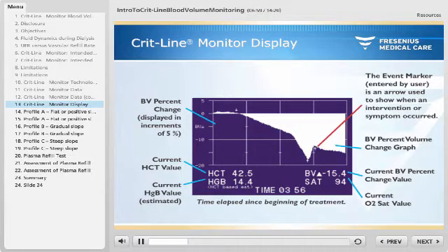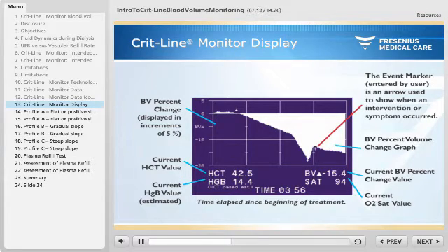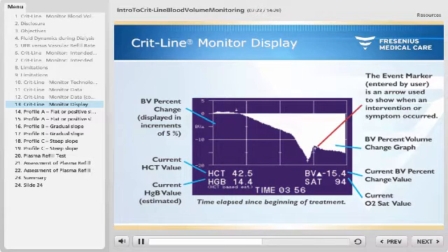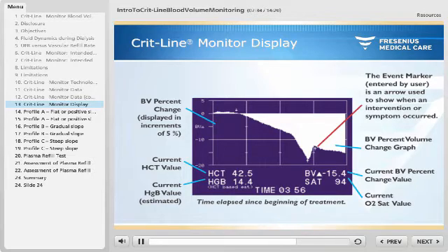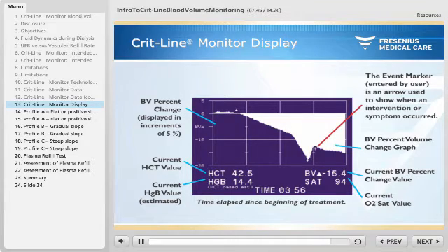Each vertical line of the display represents one hour of elapsed time since the start of dialysis. The screen initially shows four hours but will rescale if the treatment exceeds this time. The horizontal lines represent the percent change in blood volume relative to the start of dialysis; thus, the line always starts at zero. Positive values above the zero line signify an increase, while negative values below represent a decrease in relative blood volume. Small arrows can be set by the user to indicate when interventions or symptoms occurred. Below the graph are numerical displays of current hematocrit, estimated hemoglobin, blood volume percent change, oxygen saturation, and elapsed treatment time.